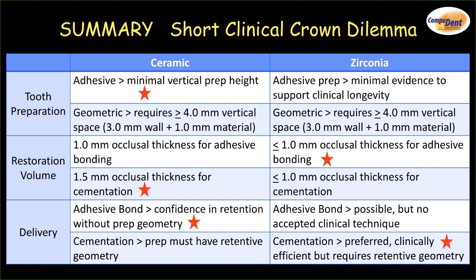The other thing to keep in mind is zirconia is not an easy material to marginate and contour and repolish intraorally compared to a glass ceramic. And so doing some of these adhesive restorations with zirconia might be a little bit more of a challenge and may not be as easy to do and get a similar good result. But I think the take-home message here is pretty clear.